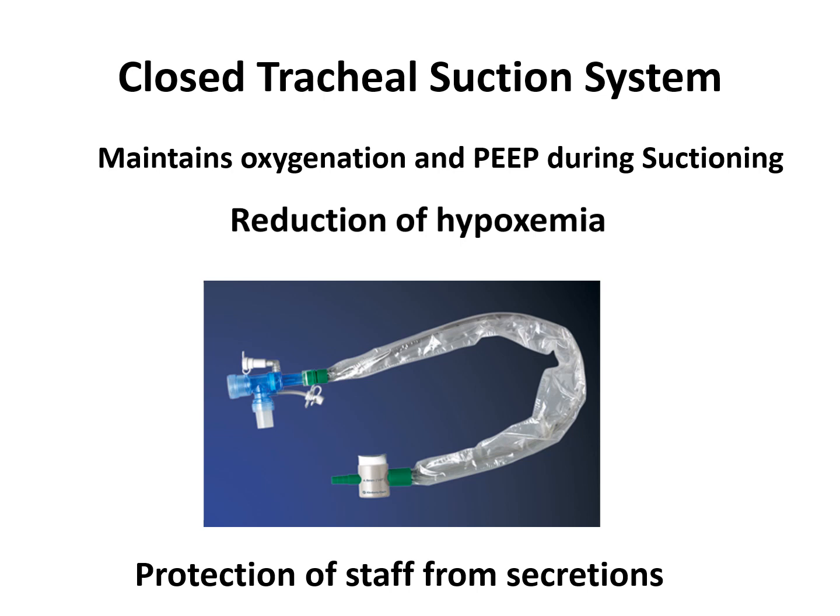So this all will help reduce the hypoxemia. It also helps protect the staff from secretions. When you're trying to suction somebody's endotracheal tube without this closed system, secretions can become airborne. So these are great things.